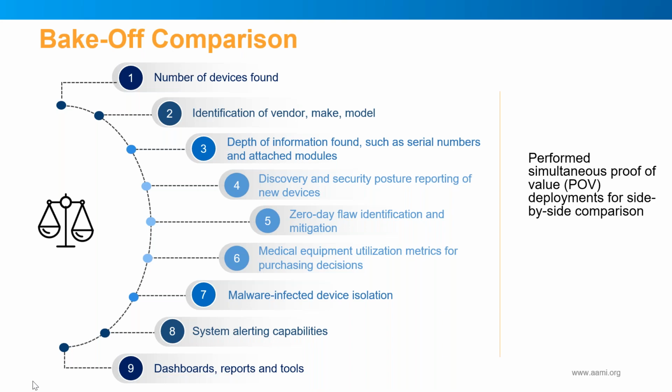So the system costs money. It does cost some money. They're not cheap. None of them are. But if you have good utilization built into your system, it will get an ROI in cost avoidance. IV pumps are another good example. Without going into too much detail, tracking our IV pumps, we're always getting pressure for, we need more IV pumps. We need more IV pumps. Well, we found out by using these tools on our new system that our IV pump inventory utilization is typically around the 30 to 35% mark.